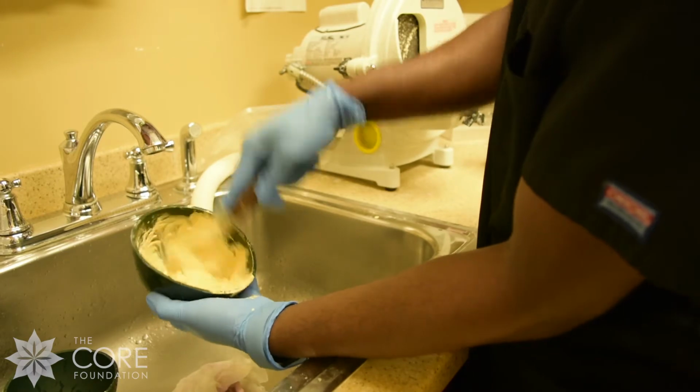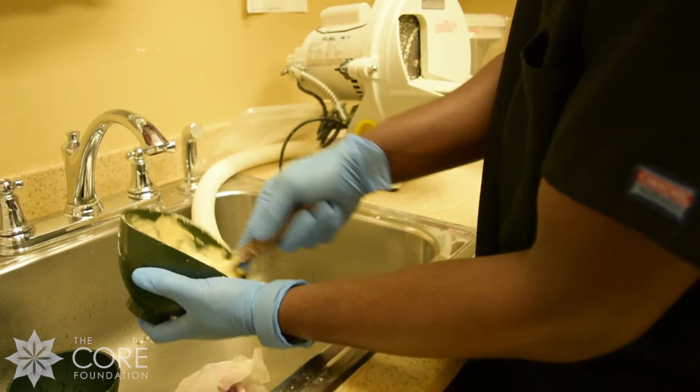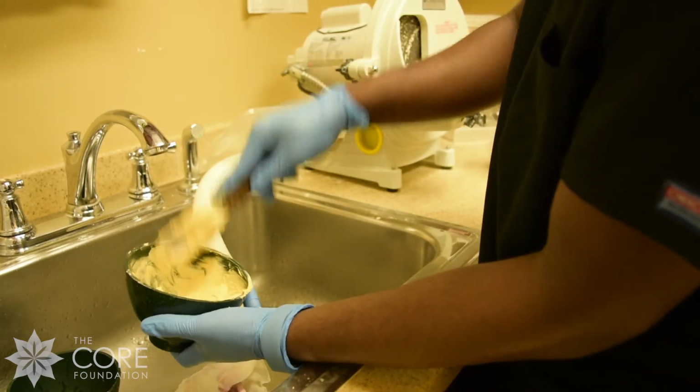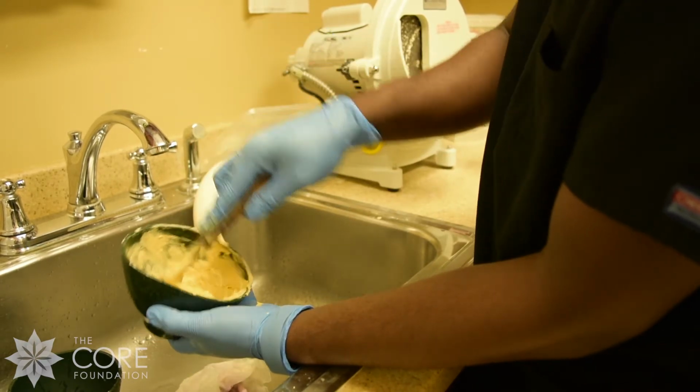And then this is a really nice consistency. You want it just like mashed potatoes or pudding consistency, where it's not too thick, at the same time it's not too runny. Like this is really nice.